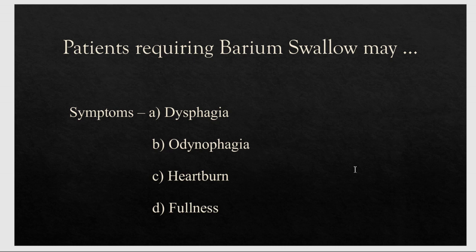And any patient who requires this barium swallow study may present to us with dysphagia or odynophagia or heartburn or fullness of epigastrium or fullness in the chest.